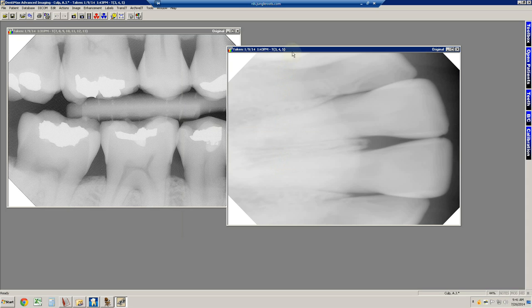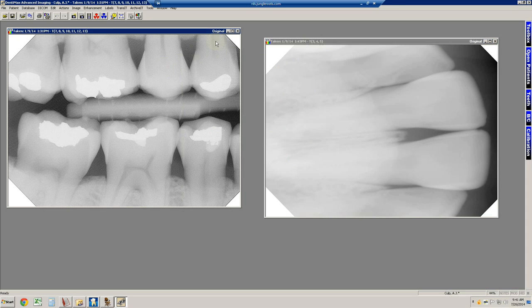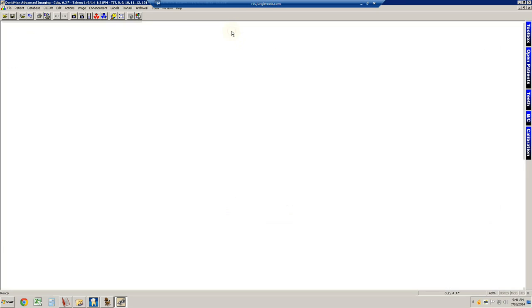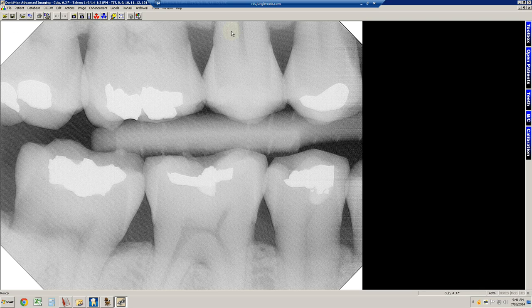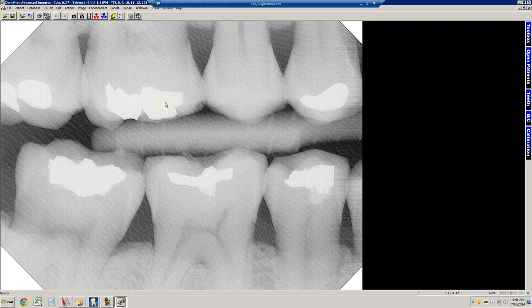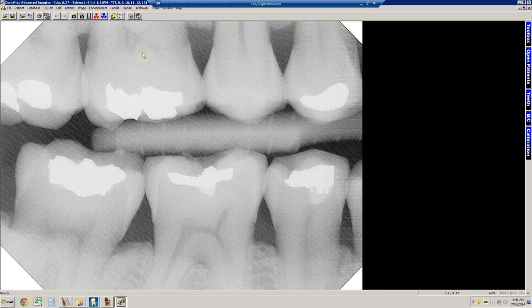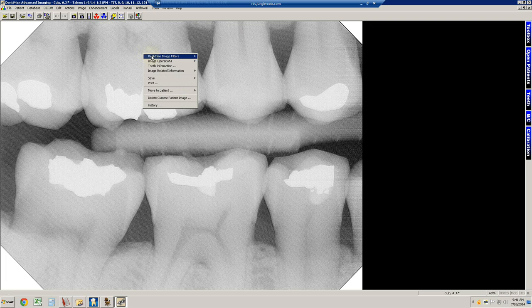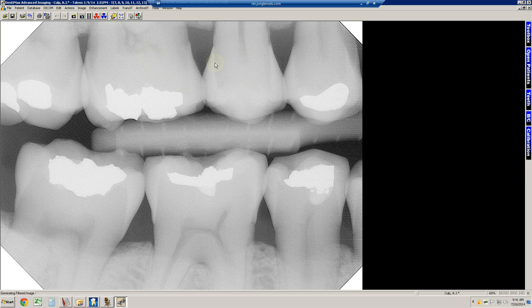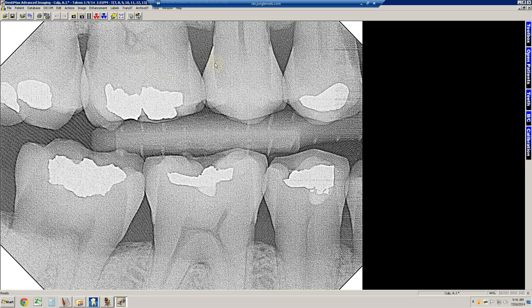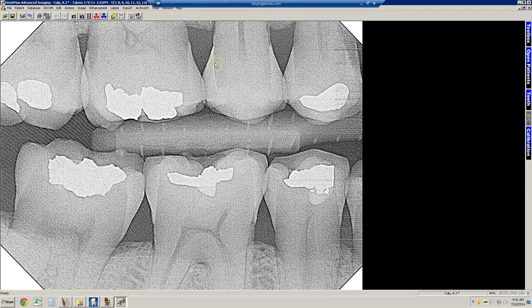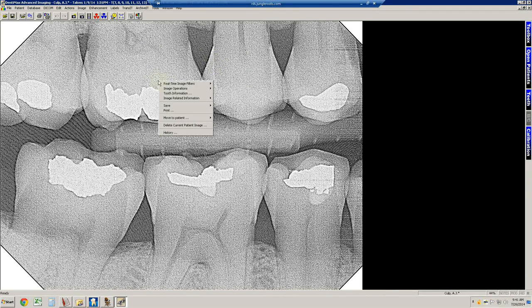Let's go to this image right here, which is a bite wing on the right-hand side. When I open it up, you can see it's not really that fantastically diagnostic. It's very grainy, very light. We can do a couple of different things. Let's right mouse click on it, and indicate it looks like there's no filter. We're going to try the Apteryx filtration. Oh, very grainy, not very diagnostic at all. Let's go ahead and remove that.